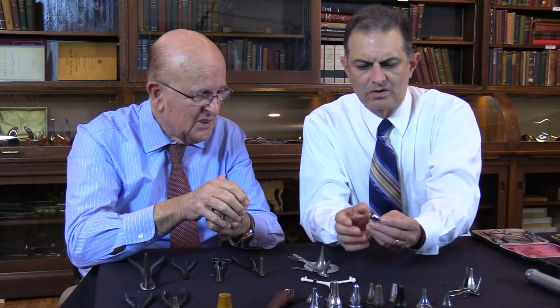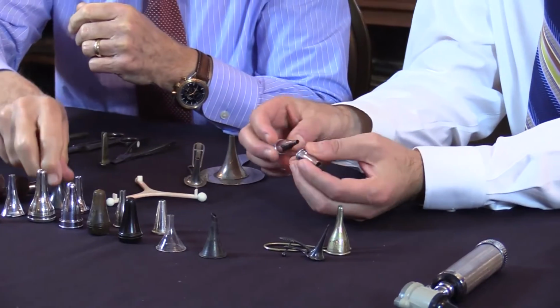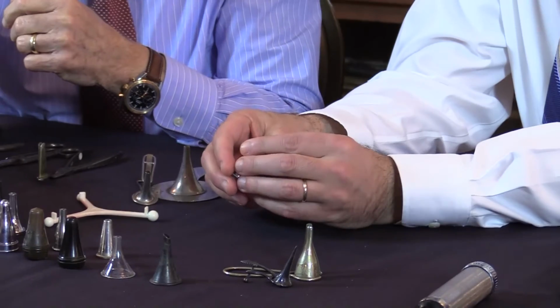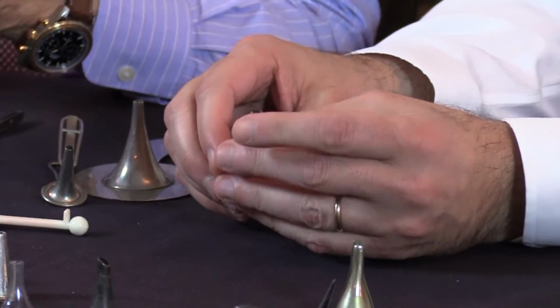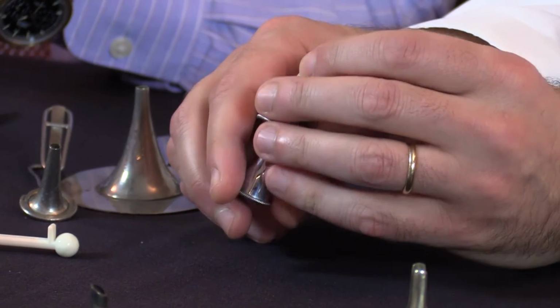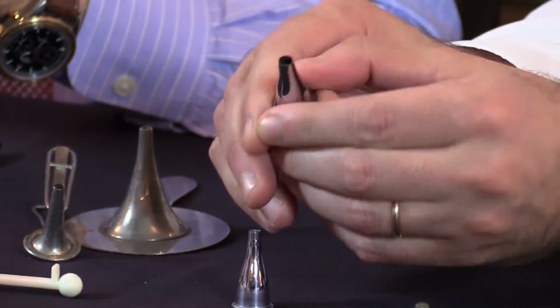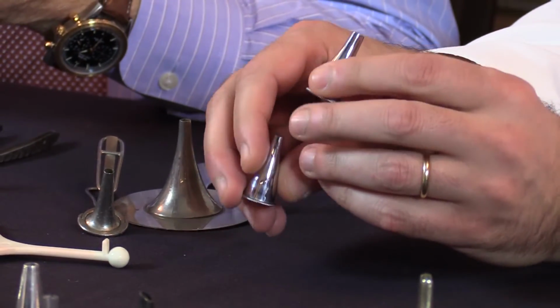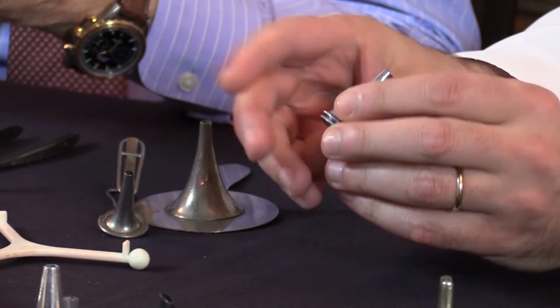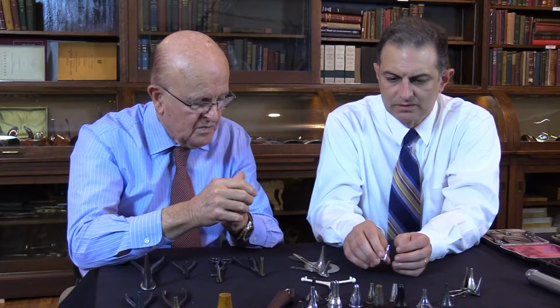So the Hartmann's specula, at first glance, mostly look the same, but there are subtle differences, as most of us in our field know, that sometimes subtle size changes, half-millimeter changes, can make a difference in the shape. These specula have a little bit more of an oval tip, and so this became a little easier to insert in the ear canal and really mirrored the canal shape much better than just the round ones.